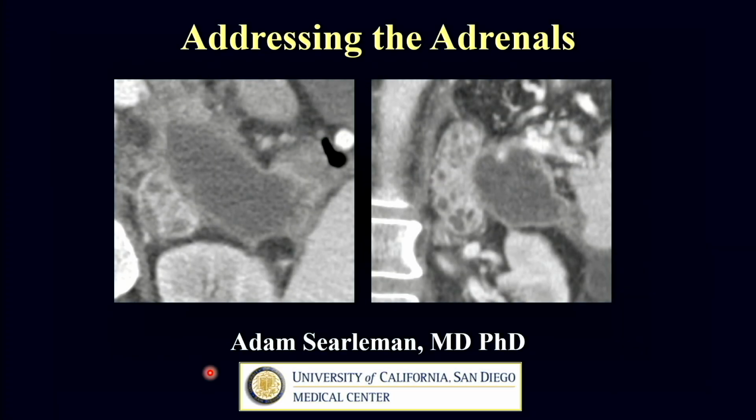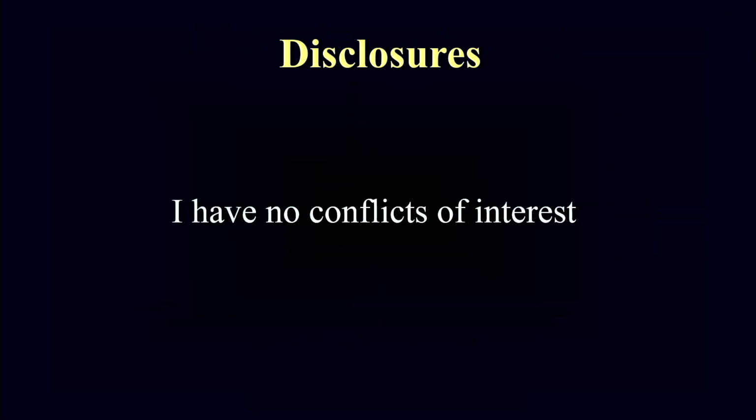So I'm going to talk about the adrenal glands. I have on here a challenge case. This thing right here is the adrenal gland, I'll just say, in this particular case. Okay, and then I have no financial disclosures or any other disclosures to make.